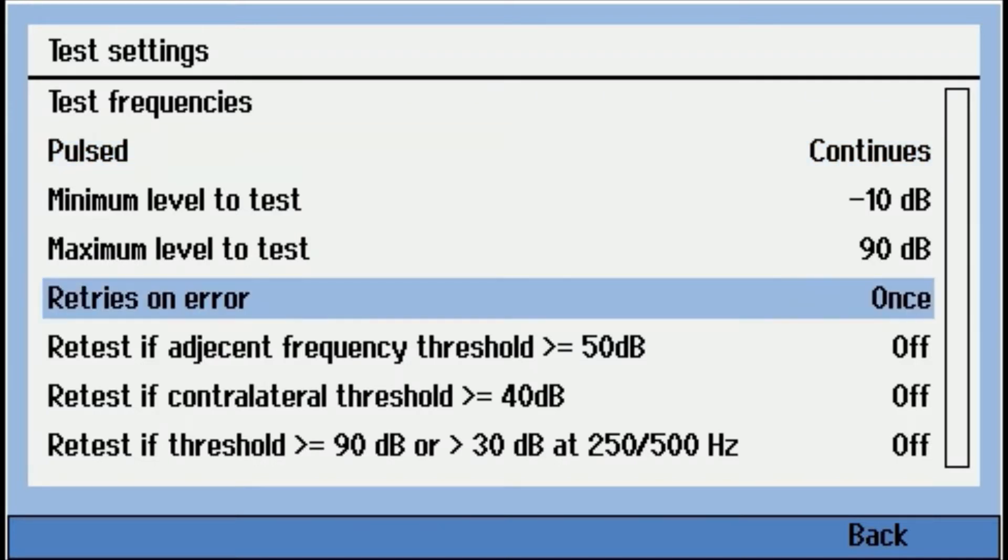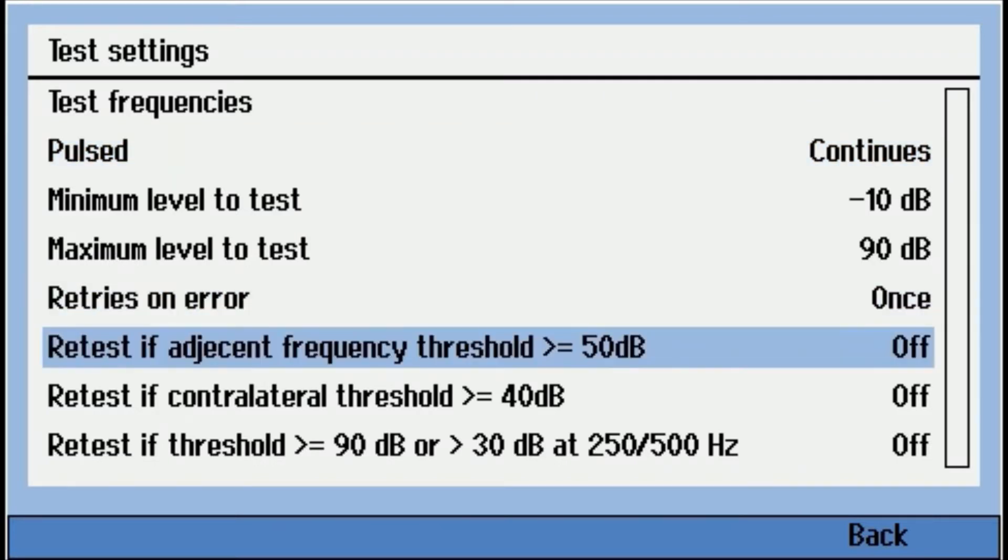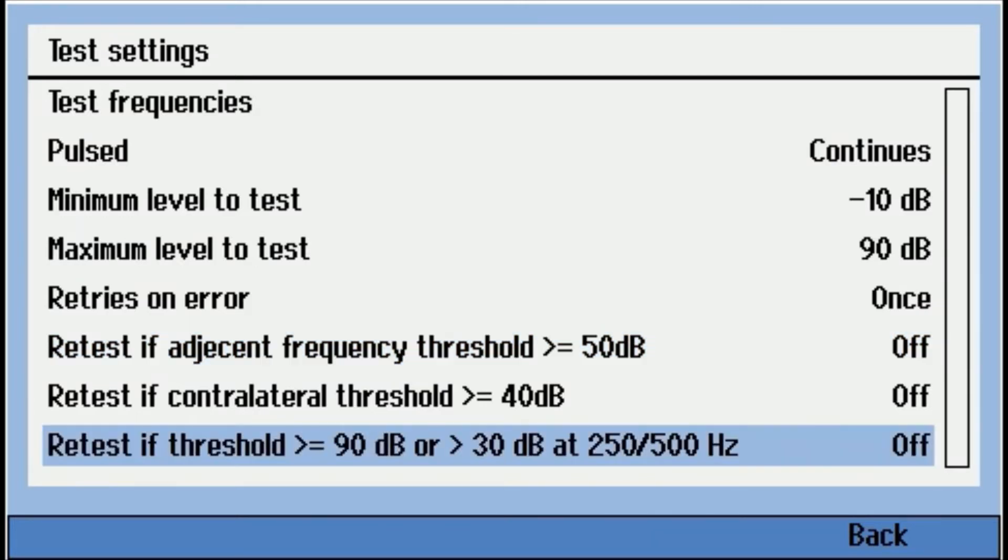There's some retest criteria. So retest if adjacent frequency is over 50 dB, if there's a contralateral threshold change of over 40 dB, if any threshold is over 90. So you can turn these retest criteria on and off. So we'll go back.